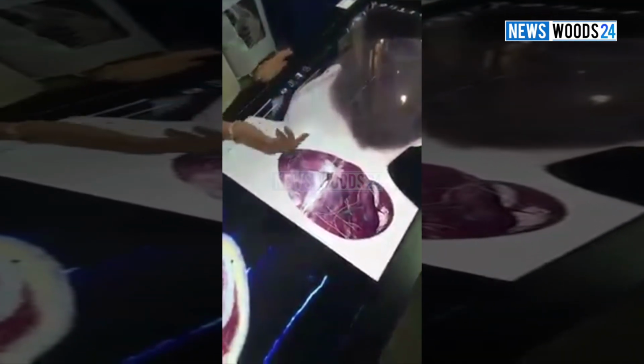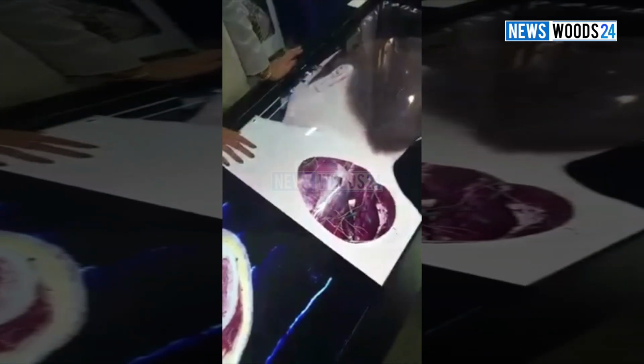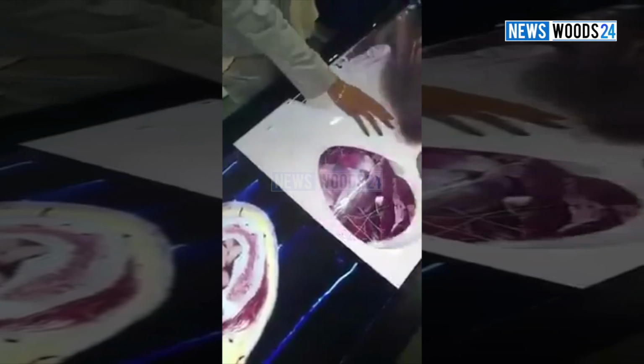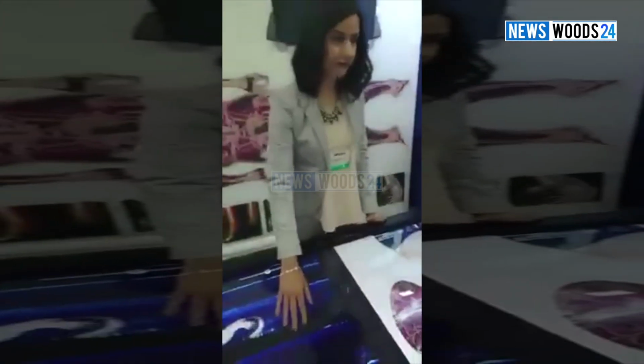To mimic something that you find in surgery, you can also do natural cuts. So in this case, I have an incision made, and you can also see the relationship between the skin, the fat, and other structures. And as I showed earlier, you can go ahead and also remove structures here and press the undo button. And what's interesting is these are actually the scans that were done from the cadaver.